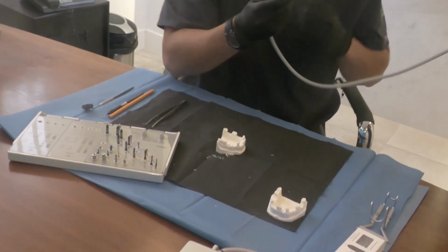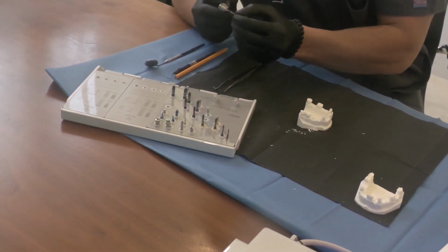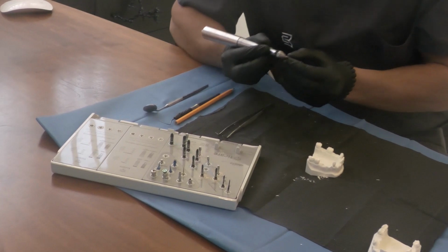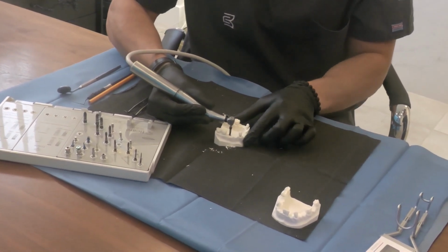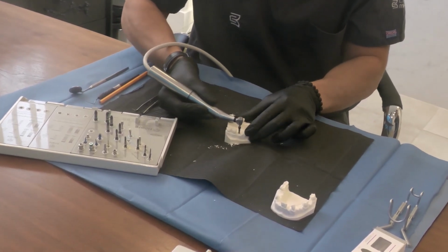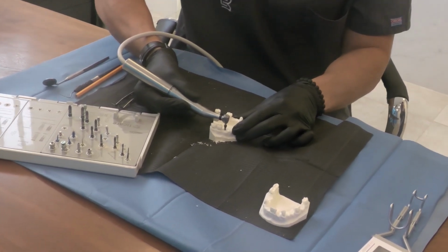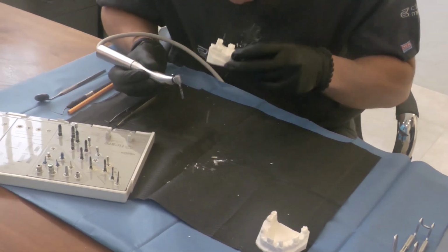Okay, so this is going to be my last drill. This is going to be a 3.3 millimeter diameter drill for a 3.75 diameter implant. Then we have two different alternatives, which I will provide you, which are my suggestions in order to be used. Okay, great. In and out, take your time. That should be always the message.